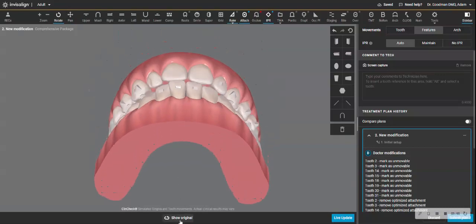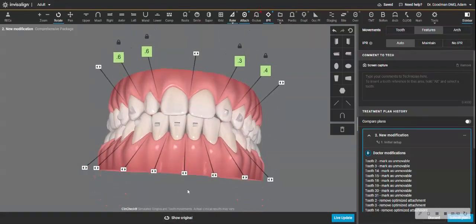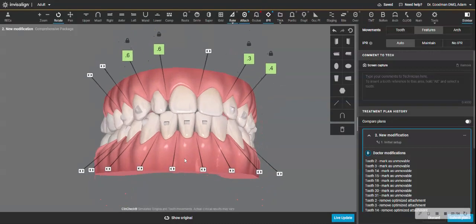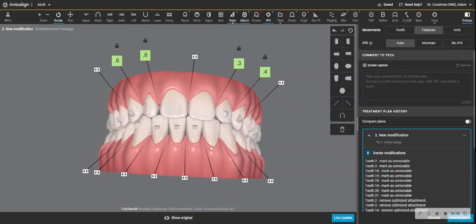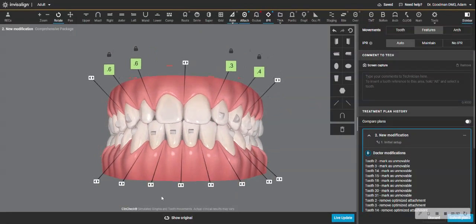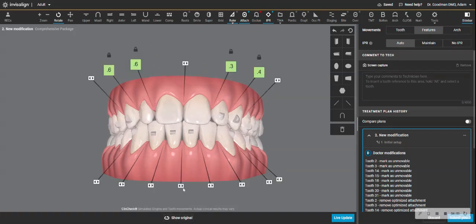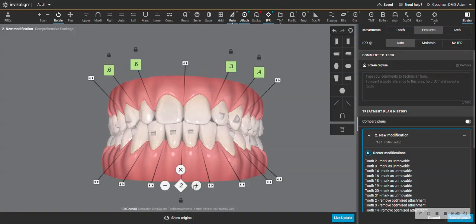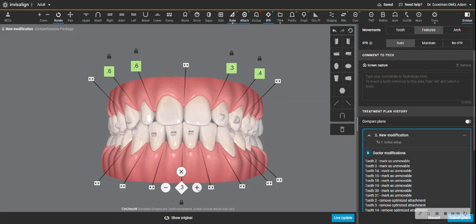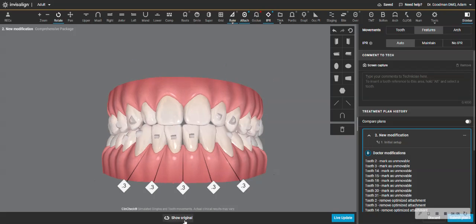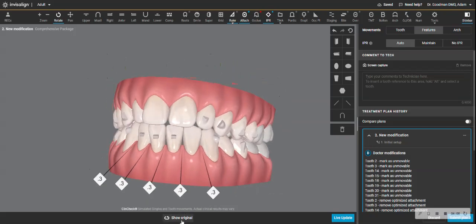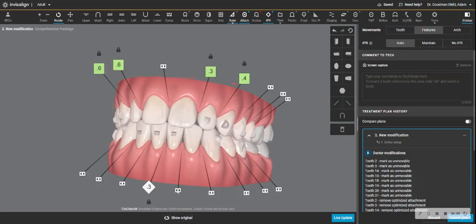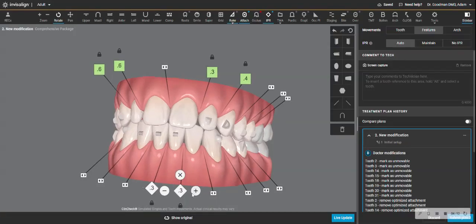Now, I'm moving the laterals out. And now I might do a little bit of IPR. And when I pick a spot for IPR, I'm going to look and see where I have a pre-existing dark triangle. So this one, yes. Here we have a pre-existing dark triangle. That's a much easier space to do the interproximal reduction.